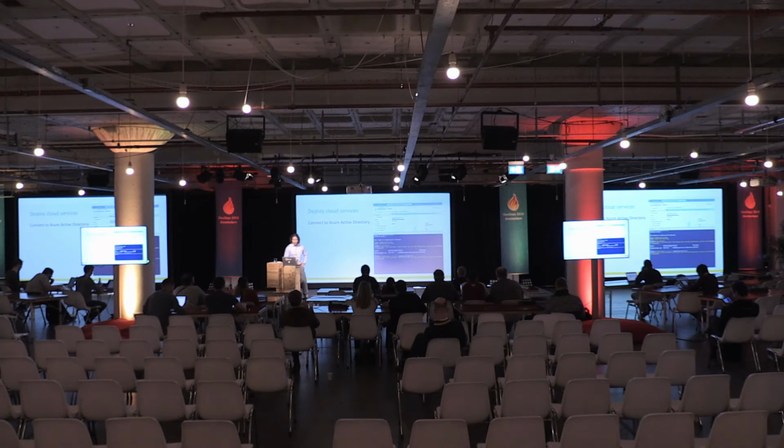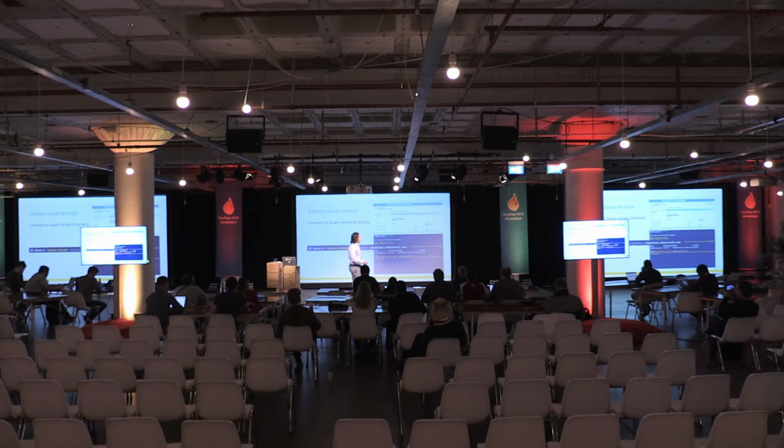Okay. So the next step is we're going to connect Azure Active Directory. So this command is connect-azuread, and you're going to pass in a parameter called tenant domain. So it's dash tenant domain, and then you get your tenant domain by copying just above where it says default directory. You're going to see something, probably your username or whatever you logged in with, and then onmicrosoft.com. So I'll go here for this side of the room. You're going to copy that, and you're going to pass that in as the tenant domain parameter.